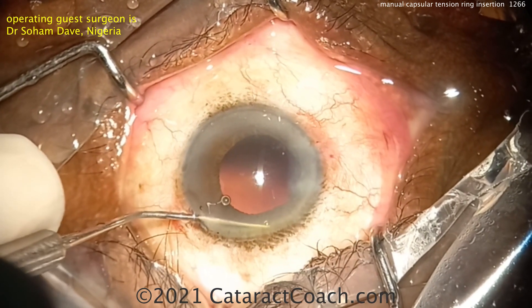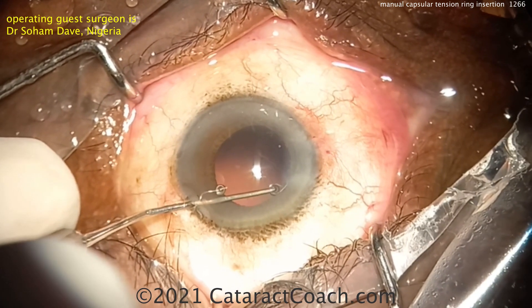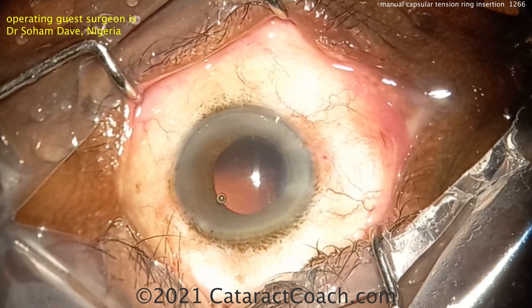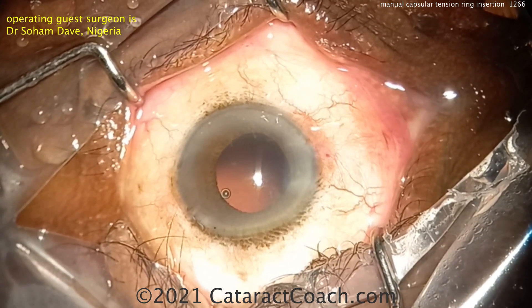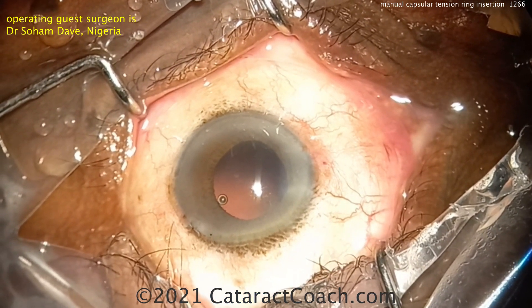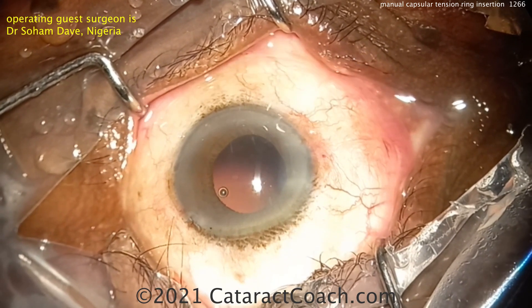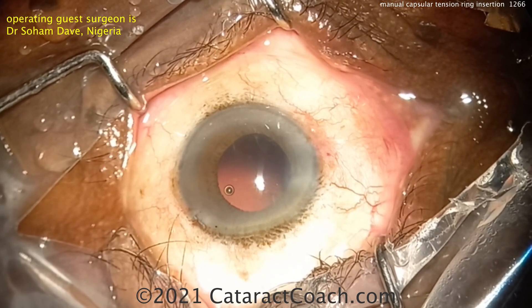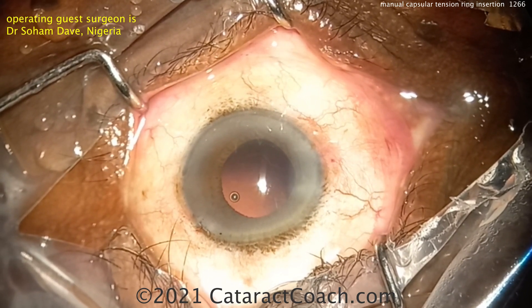Hook that with the Sinskey hook — now it's on top of the iris and angle, so we'll just fish that out. Take your time. Put it in that eyelet — there you go, now it's placed in the capsular bag. You can certainly place a CTR without using injectors. The key is: don't poke it into the capsular bag — you want it to curve around the capsular bag equator. Approach the capsular equator tangentially, not radially.